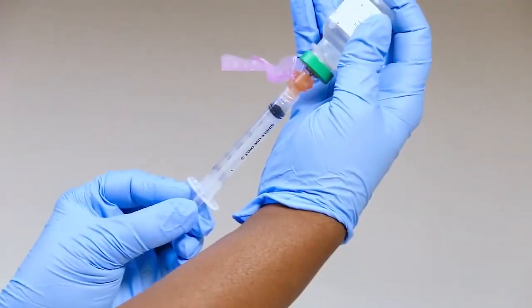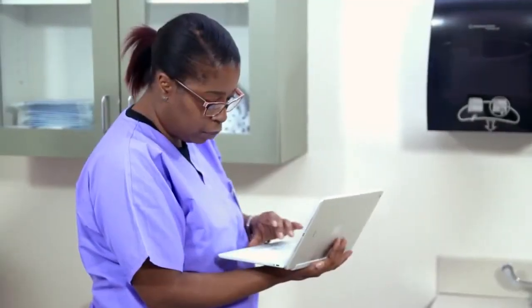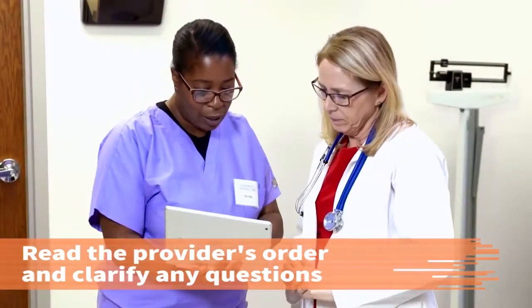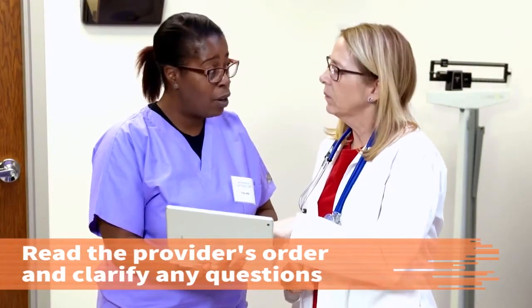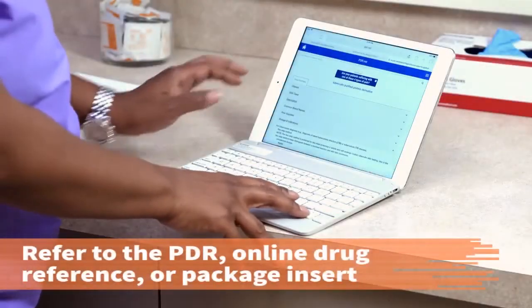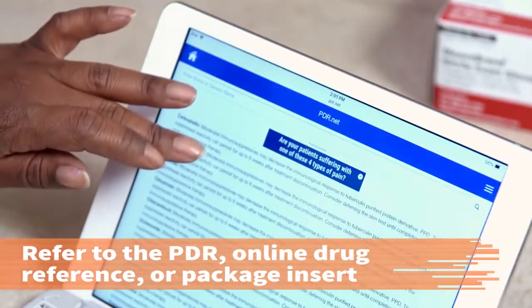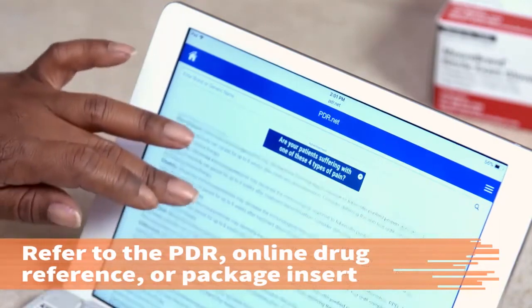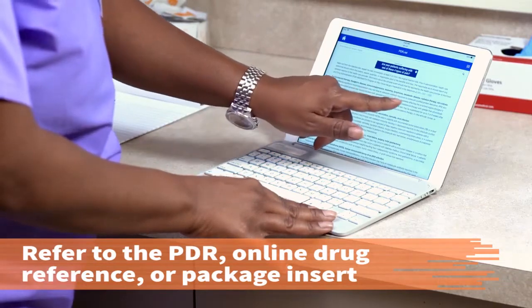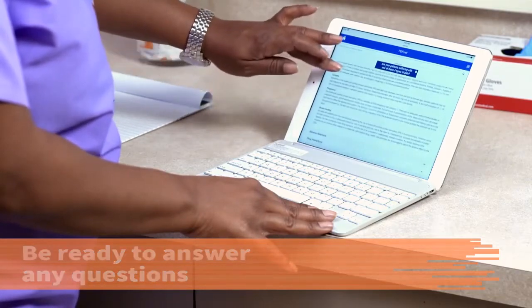In this procedure, you will learn how to prepare and administer an intramuscular injection. Read the provider's order and clarify any questions with the provider. You should never dispense or administer a drug without making sure the provider's order is legible and the details of the drug are known. If you are unfamiliar with the medication, refer to the PDR, online drug reference, or package insert to determine the purpose of the drug, common side effects, typical dosage, and any pertinent precautions or contraindications. Be prepared to answer any questions the patient may have about the medication.